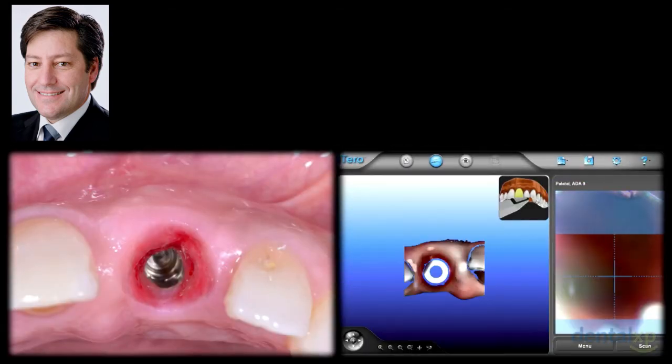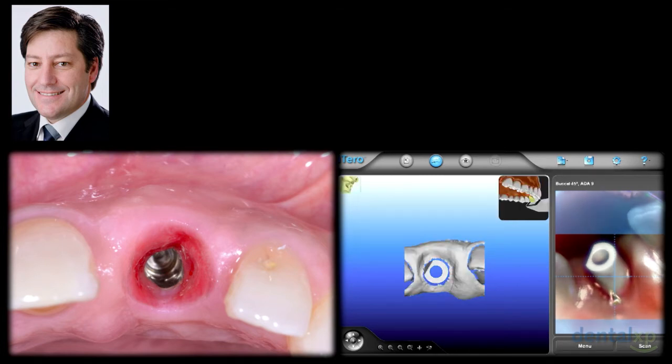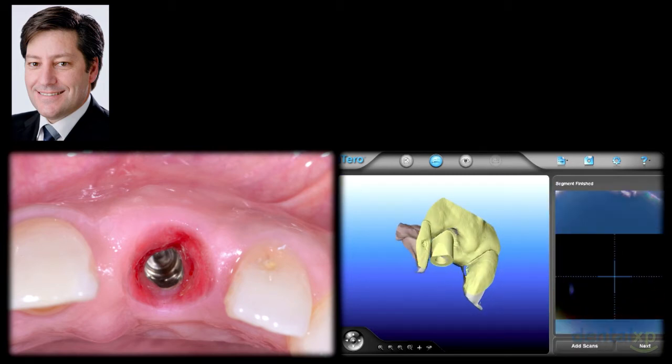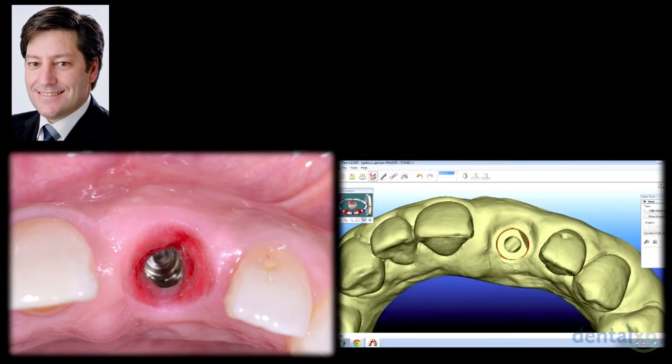So then you see the soft tissue, they have to be, in my opinion, when you achieve this level of configuration clinically, transferred to the lab technician accurately, so they can do a crown that has the same outline as the one you have. And we are now using this intraoral impression, which I think is perfect for that. You see, we just took the provisional out, we put the scan body, we scan the area, and you will see now on the video very quickly when we mark the outline of this presentation, how the emergence profile was accurately captured in this way.